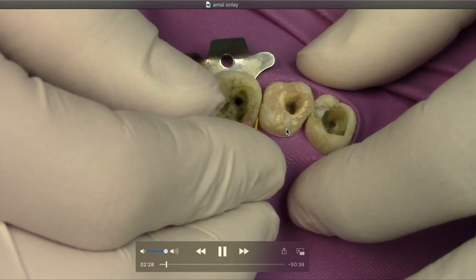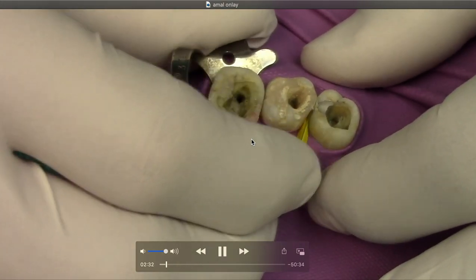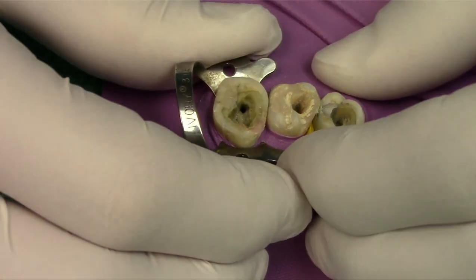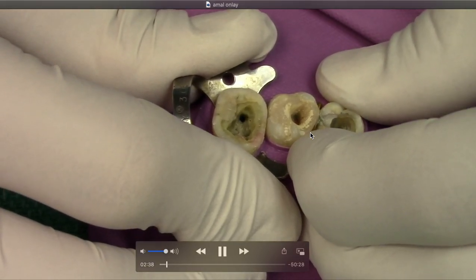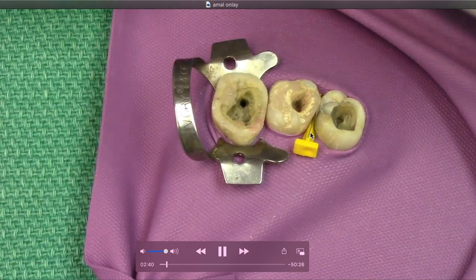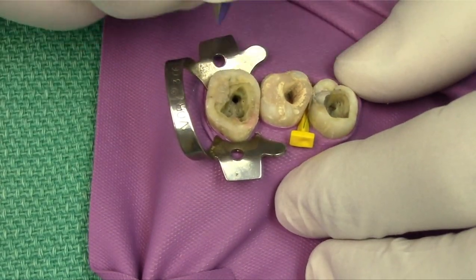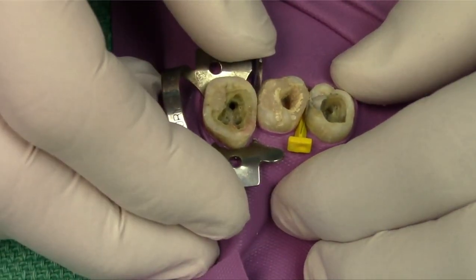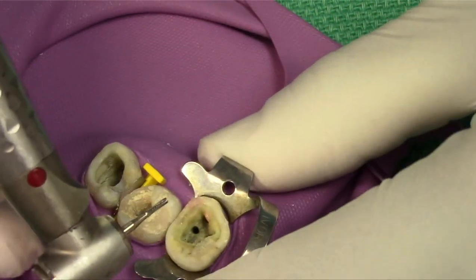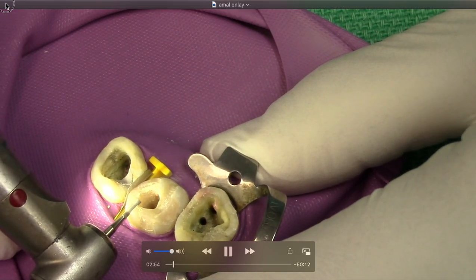We'll pretend this is an upper six. If you haven't used these little defender wedges — I think they're from Garrison — they work really well, especially when you're brand new, to protect the adjacent teeth. It also pre-wedges, which might actually increase your contact strength, especially if you're doing composite. We're doing amalgam now, just like in real life. If you try to put two wedges in, it just doesn't work.